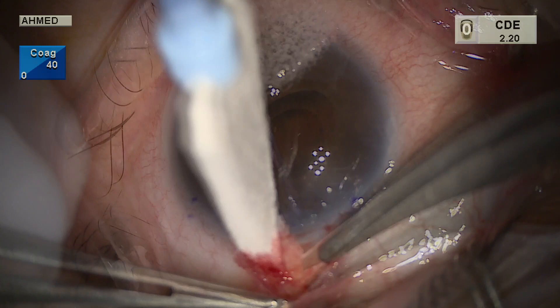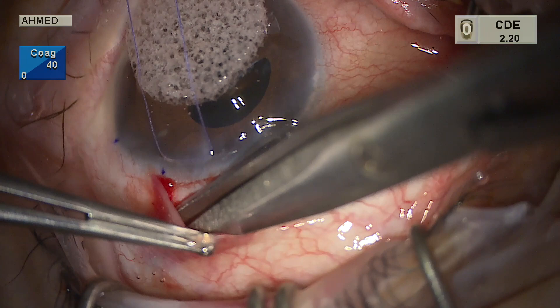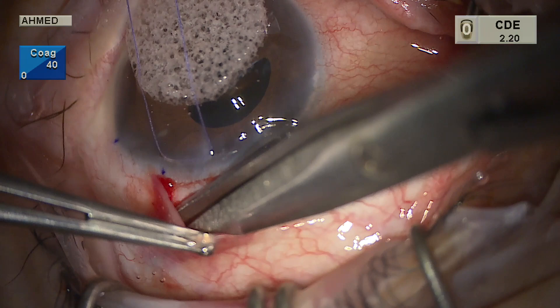We're using blunt Westcott scissors to cut Tenon's insertion, which is about a millimeter back from the conjunctival insertion. Tenon's may be attached posteriorly, so it's important to do this under direct visualization and not to leave Tenon's in the scleral bed.